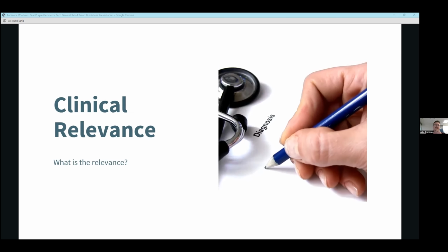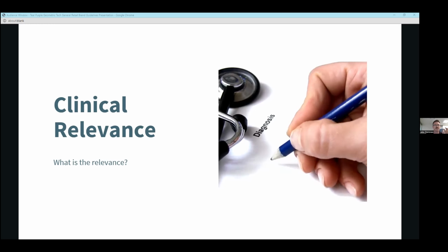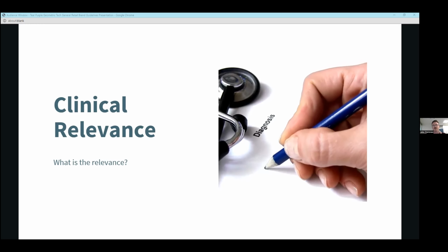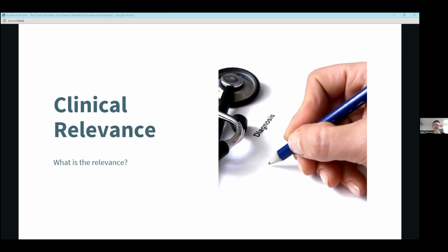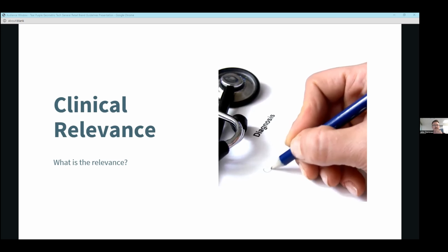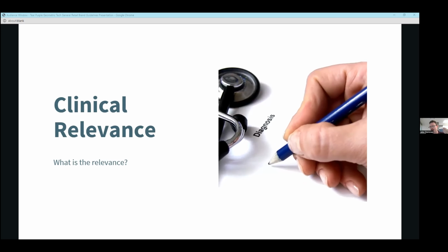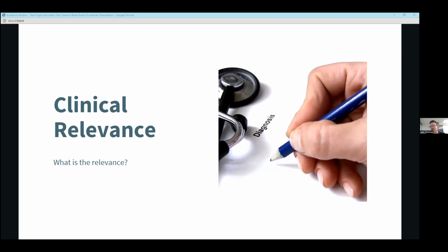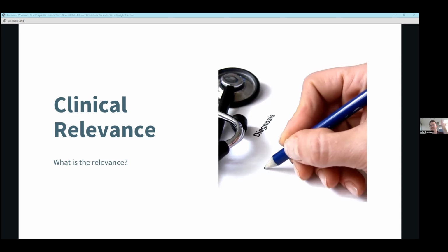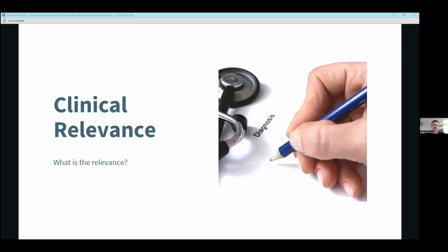But then the 2023 consensus statement says that the correlation between anterior subpleural consolidations and irregular pleura is not well understood and requires more research. So, I guess you've got to take that all with a pinch of salt. There've been systematic reviews and meta-analyses that said that these signs of consolidation are enough to diagnose pneumonia, but then these consensus statements say not so much. So still some work to be done.